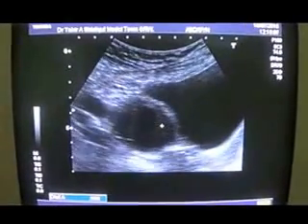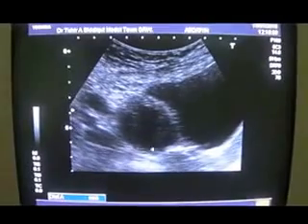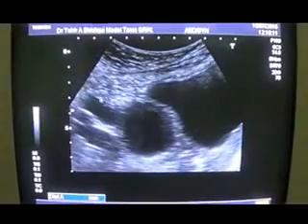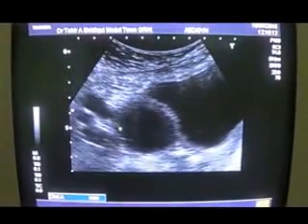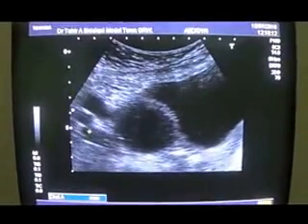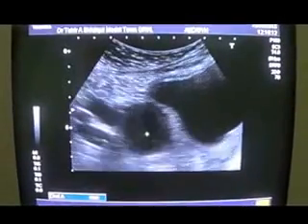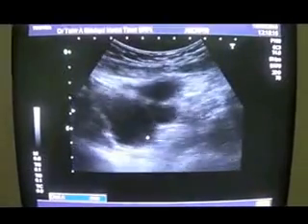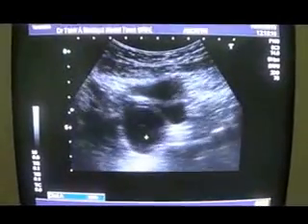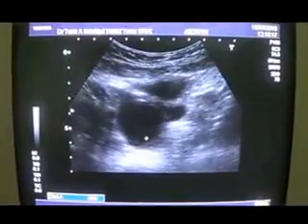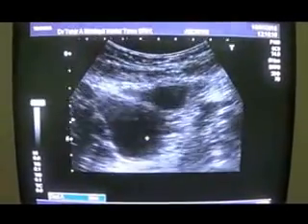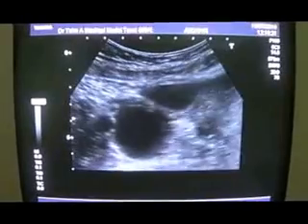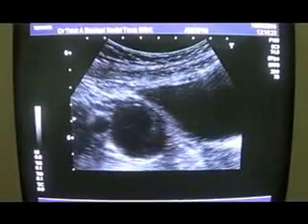You see, this is the cyst and this is the fluid pocket. These are the vessels. And we do see that the cyst is not absolutely clear of internal echoes.